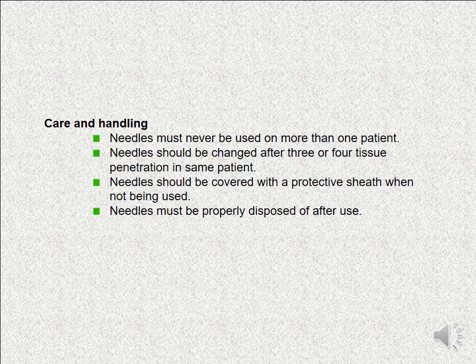In fact, there are two ends of the needle: the shank, which is covered by a protective sheath, and the syringe penetrating end, which is also covered by a sheath. To protect the patient, yourself and the assistant from any accidental penetration by the injectable needle, keep the sheath over the shank and the syringe penetrating end. The needle must be properly disposed of after use.